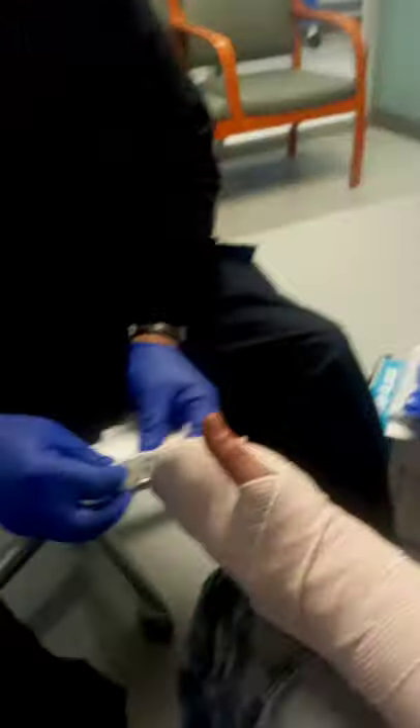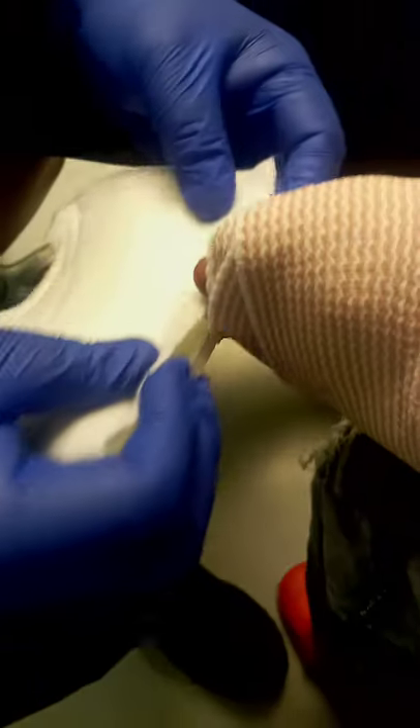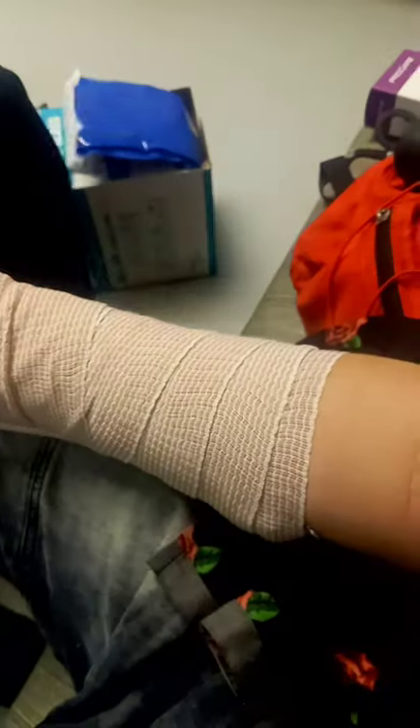Do me a favor, wiggle your fingers for me. There you go. So right after that happened, I was trying to grab my bike and my bag in my hand, and it wasn't even like reacting. The reason I fold that down is — just feel that with your fingers. Feel how coarse that is? That's what's on the back end of that. I don't want that rubbing against your skin however long you're going to have this on.